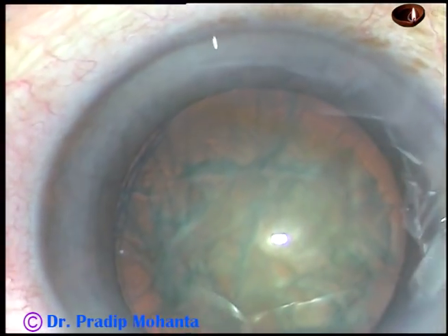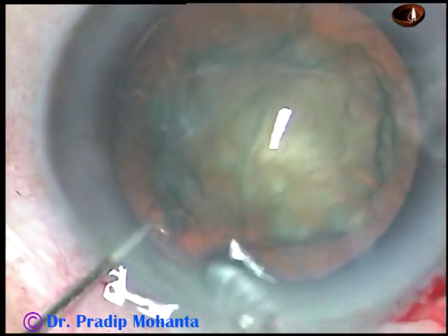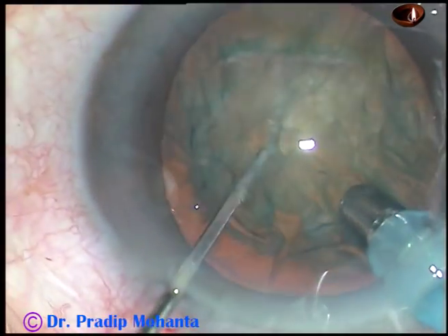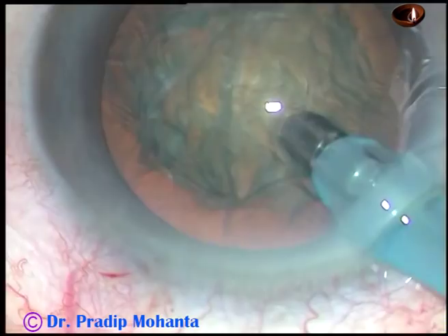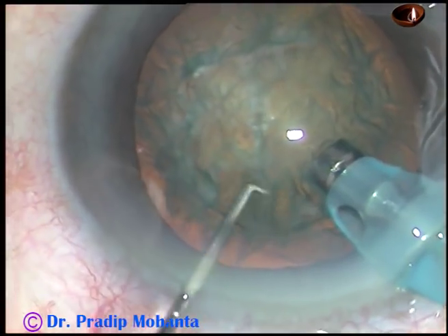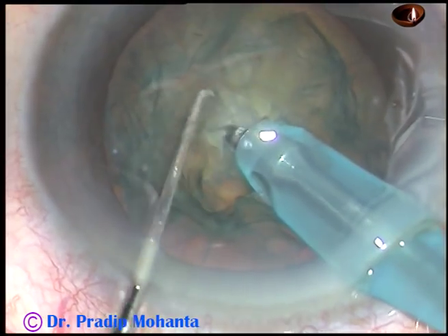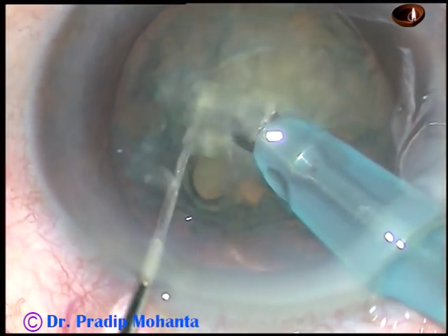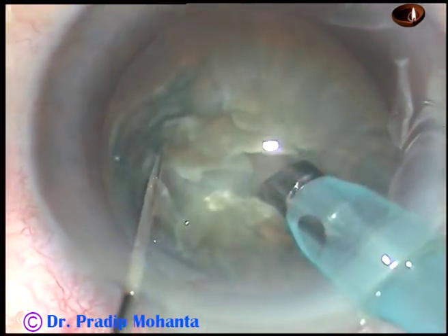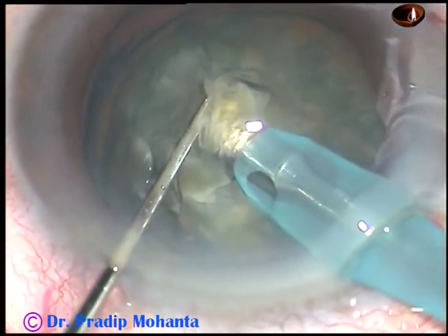And now is the time to introduce the phaco handpiece. I inject viscoelastic substance, go bevel down over the lens surface, then turn the phaco handpiece to make the bevel up, and go into the substance of the nucleus. I did not try to aspirate cortical matter first in this case because the instrument would need to be over the lens and could touch the cornea — the chamber is very shallow in this case.